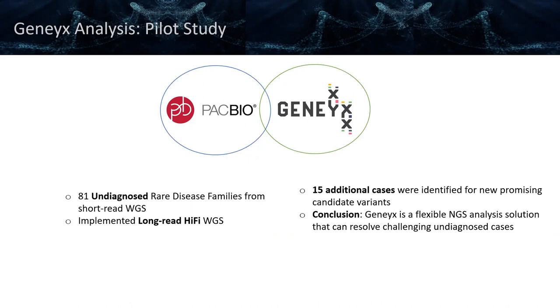And so the conclusion that we basically extracted from this pilot study was that Geneyx is really a flexible NGS analysis solution that can resolve the challenging undiagnosed cases, but it is also valuable because it can work with a variety of different file formats. So this includes targeted gene panels, whole exomes, whole genomes, as well as short read and long read data.